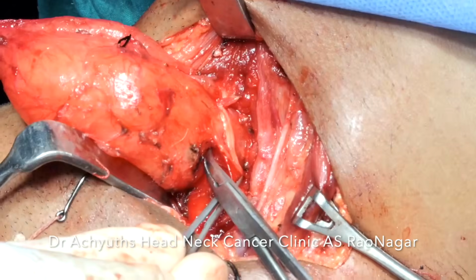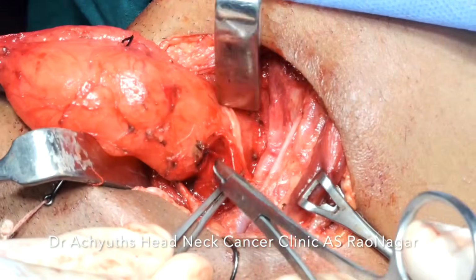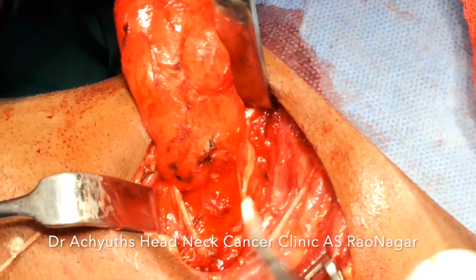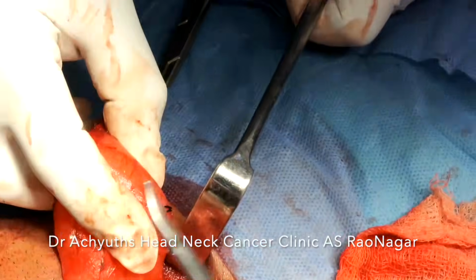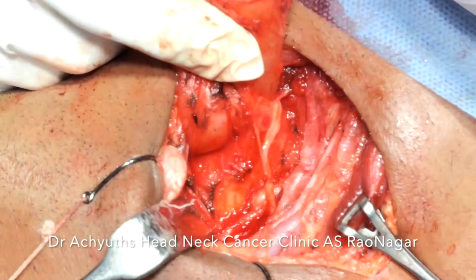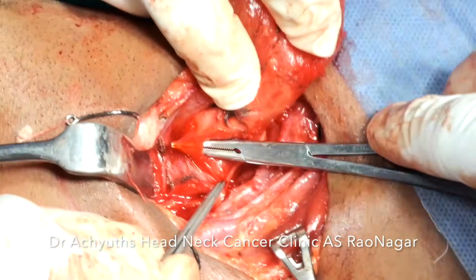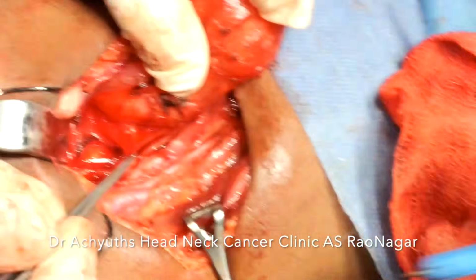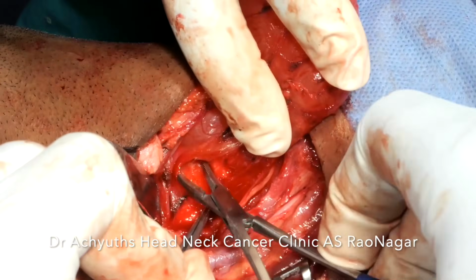Now almost inferiorly the attachment of the internal laryngeal nerve with the cyst wall is separated. Now the cyst is 90% out of the attachments. Now we are only held by the cyst wall attachments with the endolaryngeal component, the internal component. The external component is almost done.